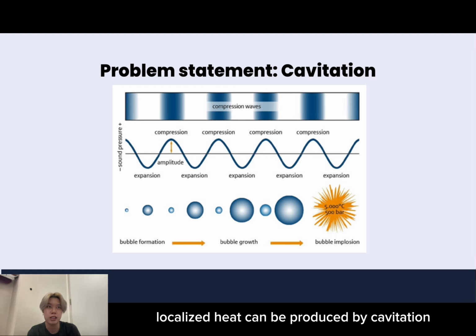In certain instances, this heat may contribute to thermal effects, raising the tissue's temperature. Excessive or uncontrolled heating could harm the intended region. Hemolysis is the term for the phenomenon where the red blood cells burst as a result of cavitation. This could happen if bubbles burst close to blood vessels, mechanically harming the blood cells.